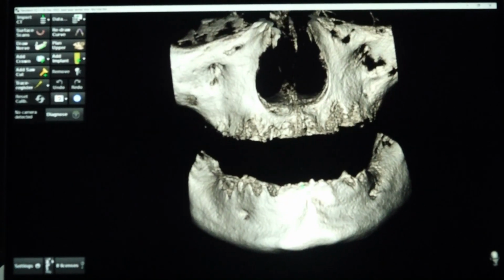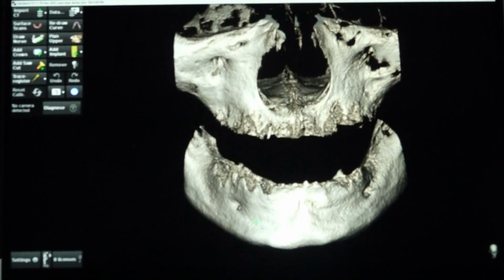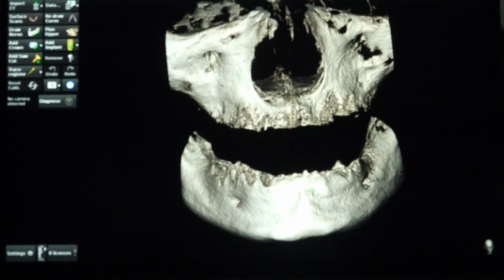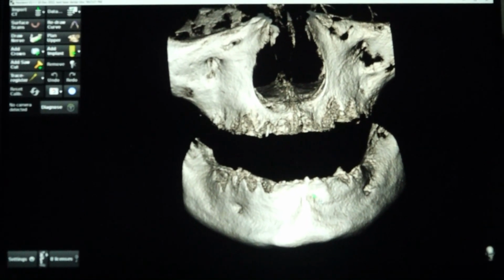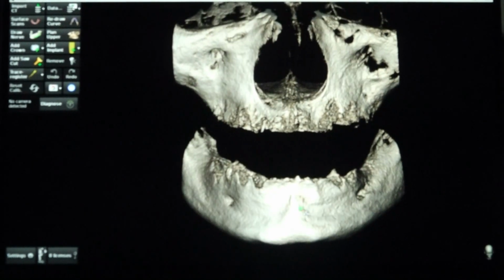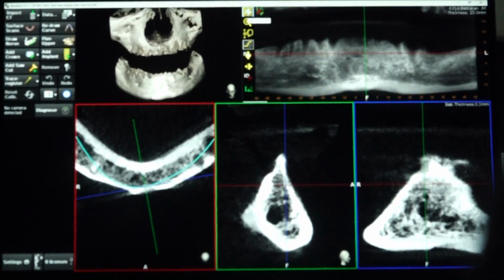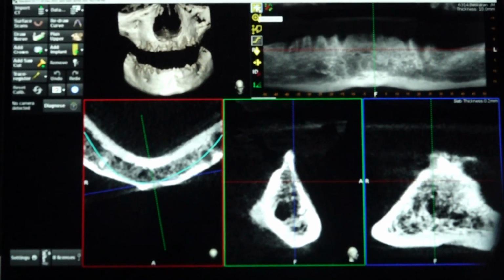So how much alveoloplasty do you need to do? You have to use this 3D reformatted view. You will get a fair idea, and also correlate with the clinical prosthetic space. Make the patient close in the CR position. Then you can evert the lips and judge how much prosthetic space is present on the right, left, and anterior spaces. So the first step is alveoloplasty: where it is needed and how much is needed. These are the two factors.